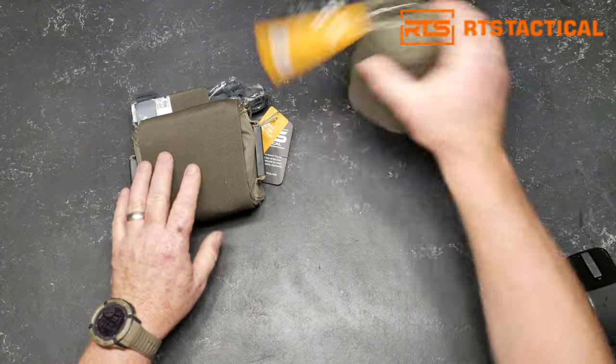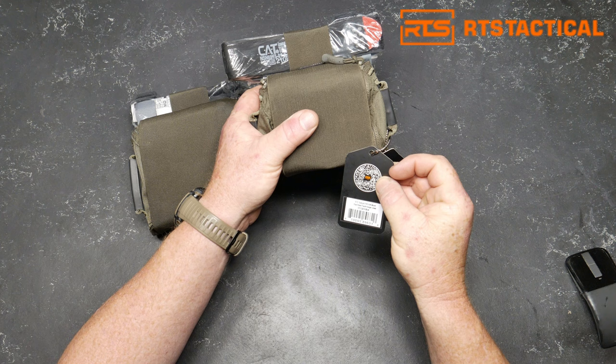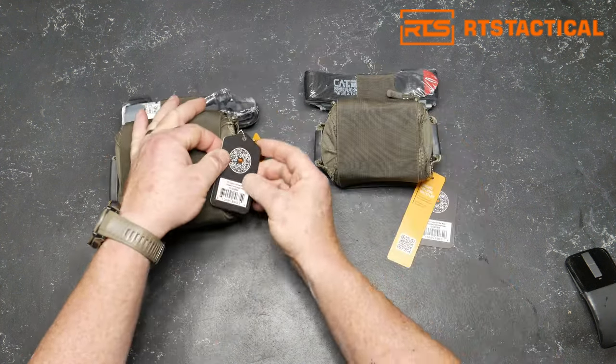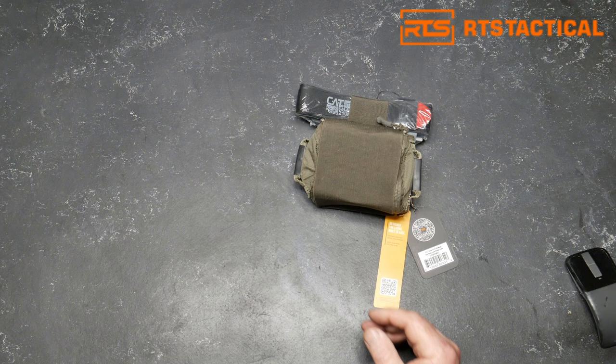There are two different makes right here. This is the IFAC Mini, and this is their bleed pouch. This one is the IFAC. We're going to do a two-part series — this is part one, and we'll do the other one tomorrow.